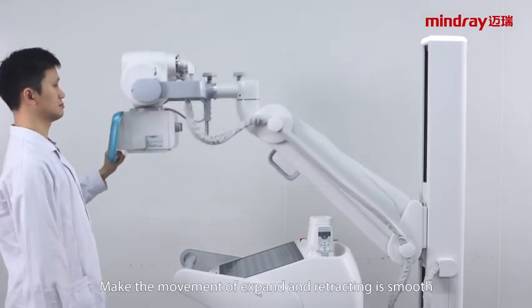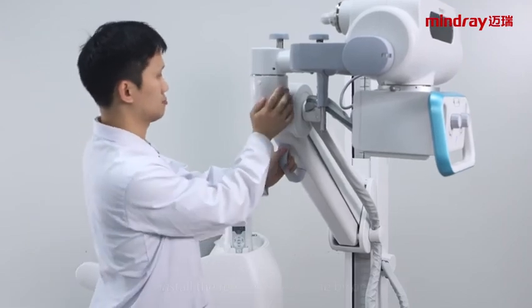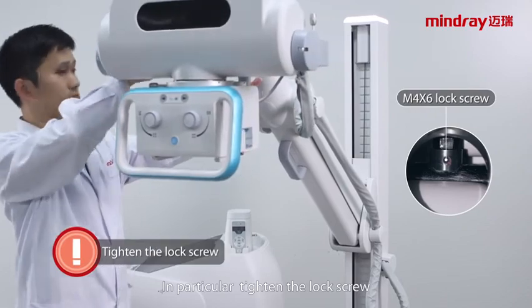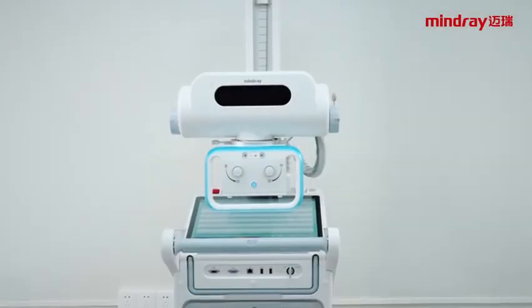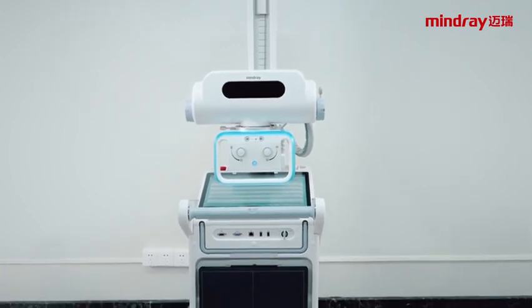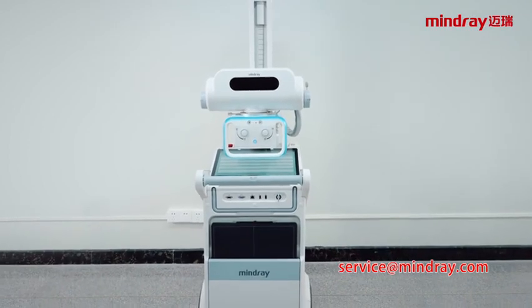Make the movement of expanding and retracting smooth. After adjustment, install the removed parts one by one. In particular, tighten the lock screw. These are the main contents of MobiEye 700 general maintenance. If you have any questions, please contact MindRay Customer Service.